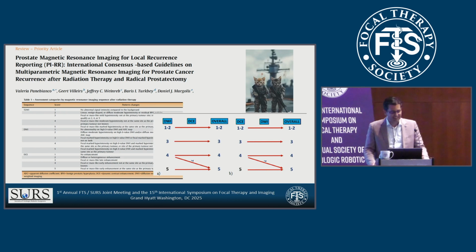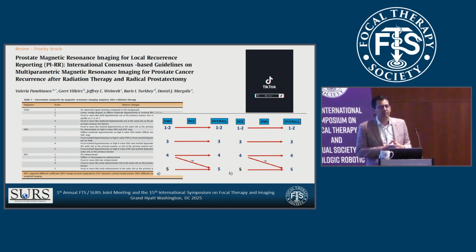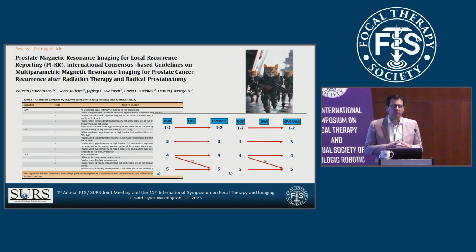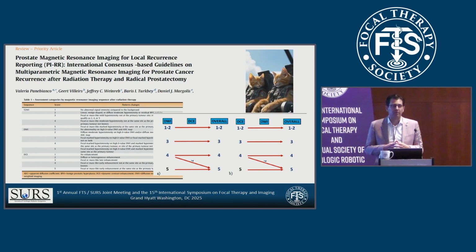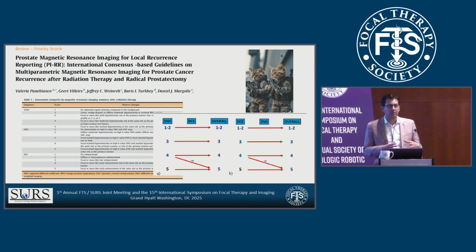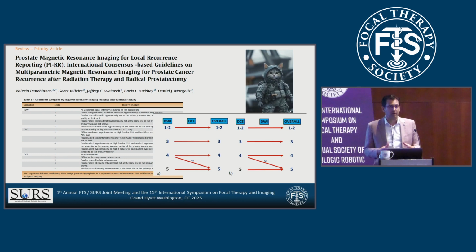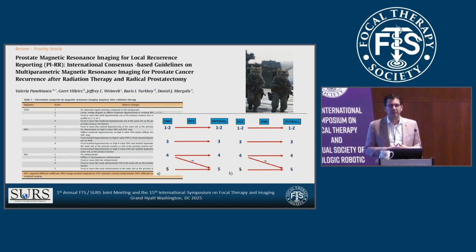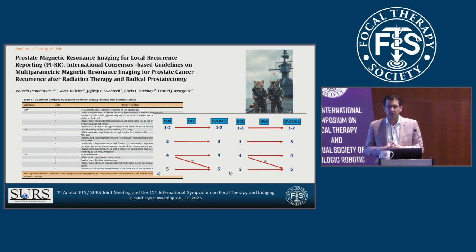It's pretty consistent. So this is looking at DCE or DWI as the dominant sequences. A treated prostate that's been radiated shouldn't be enhancing still, right? You have residual tissue, something that's still enhancing. And I would tell you during the days of the early CyberKnife, their dose was on the low side. Some prostates look completely normal 6 months after therapy. And we know if we do a biopsy on those, you have to wait at least 2 years for the biopsy to be negative if you're doing focal radiation therapy to a lesion.